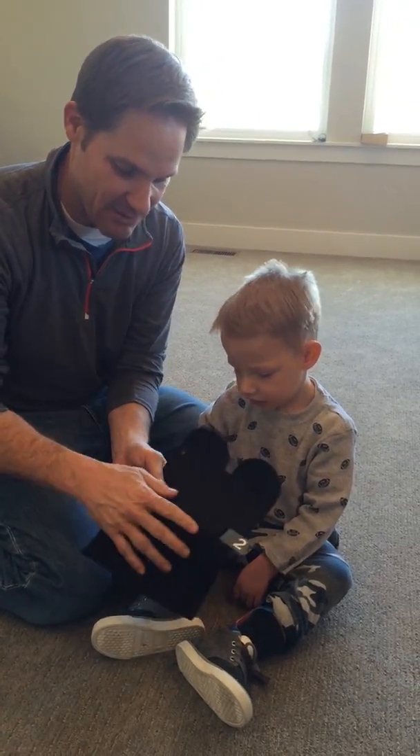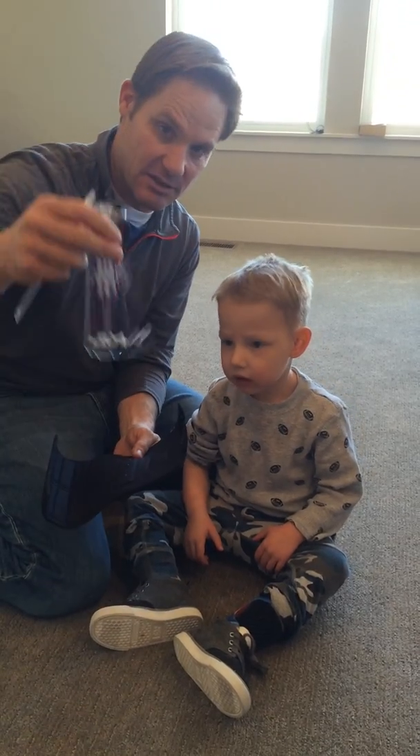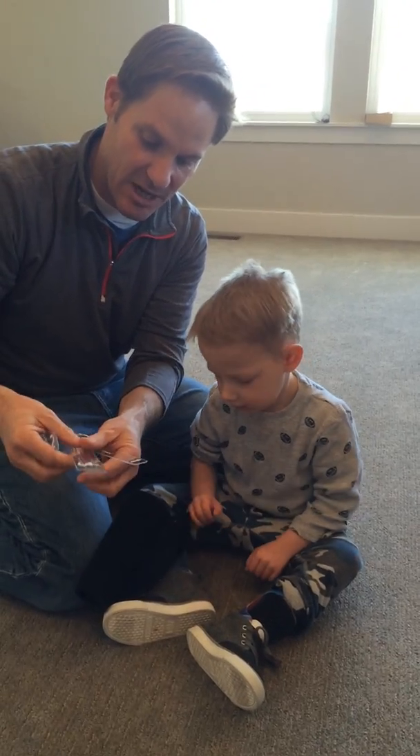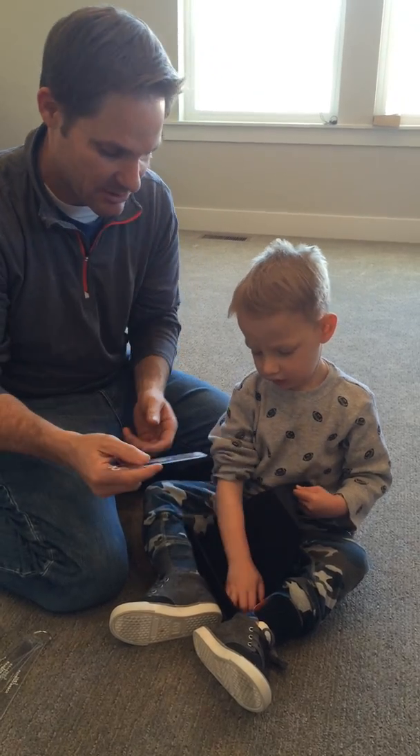Let's show. So we have a number two stay in there. We take the stay off the keychain that comes with the different stays. Number one is most flexible and number five is most rigid. We're gonna put the number two for Bronson.